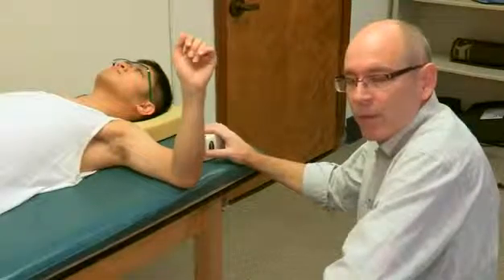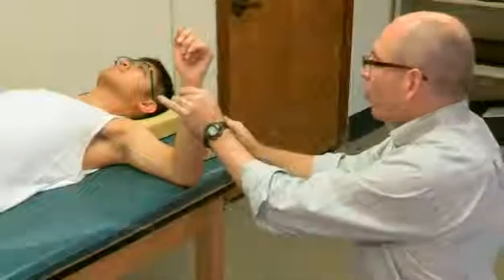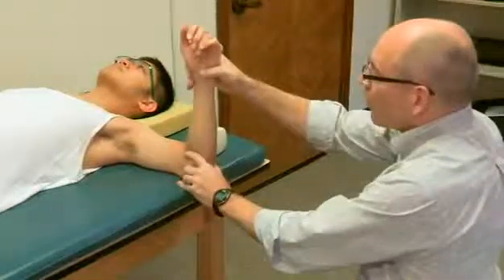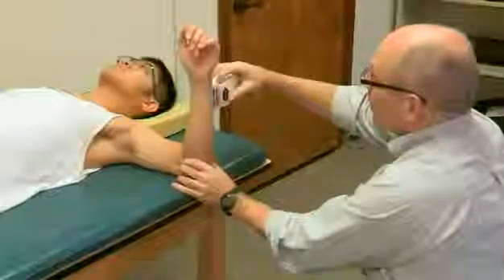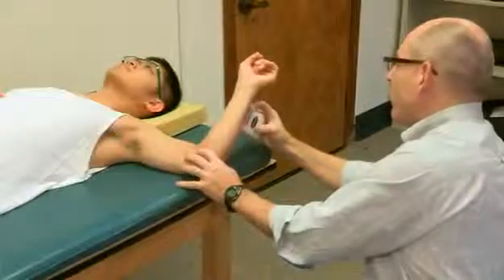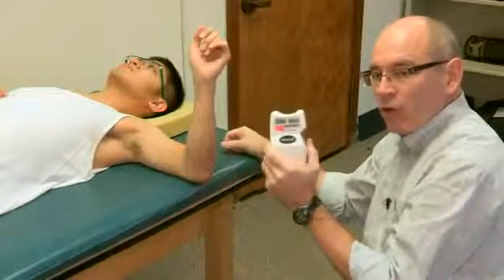Now for illustration, we're going to measure several upper and lower limb range of motions, starting with the shoulder. We're going to measure shoulder external rotation. His shoulder is abducted about 90 degrees, and our starting position is with the forearm vertical. I place the inclinometer on the forearm and set it. Roll it back as far as it'll go. I reset it and find he has 45 degrees of shoulder external rotation.